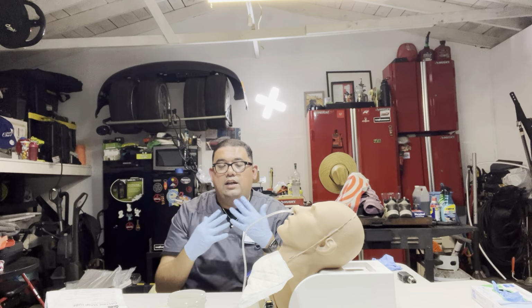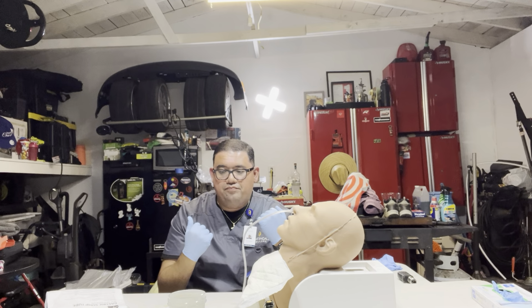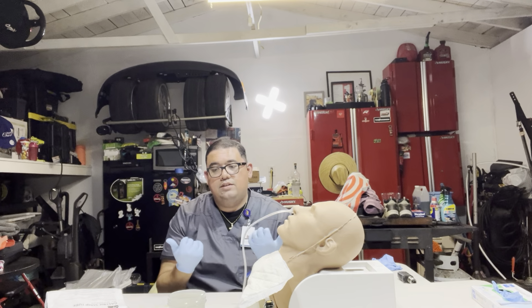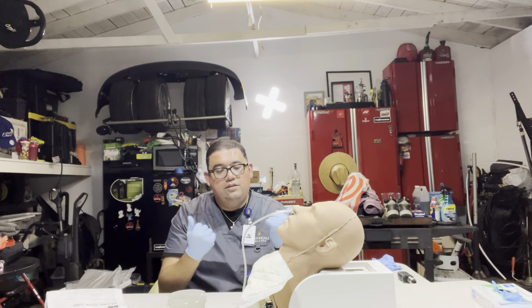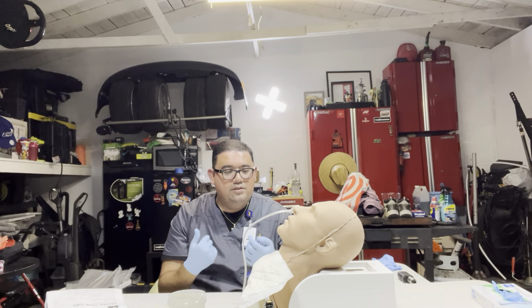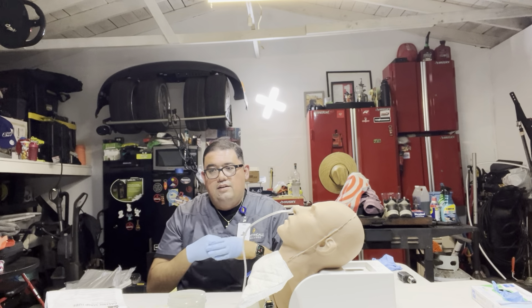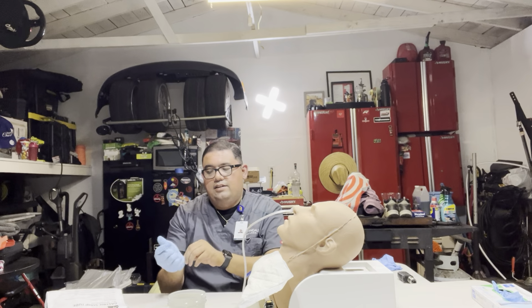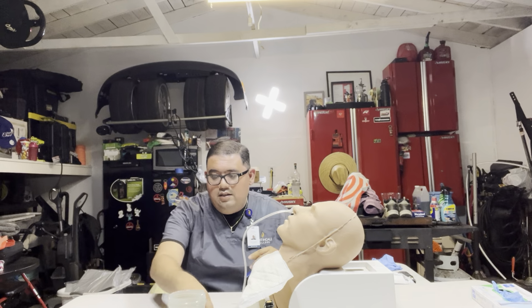After that's all done, whether it's for nutrition or for gastric suction, whatever your order was for, you would apply the tube feed or the suction apparatus to help extract the gastric contents if there was a blockage and you needed some of that removal, or of course, like I said, enteral feeding. After you're all done, you'll throw everything away and get everything in place.